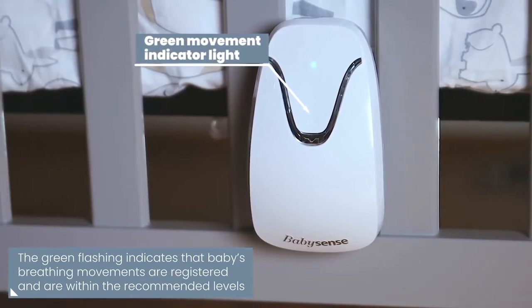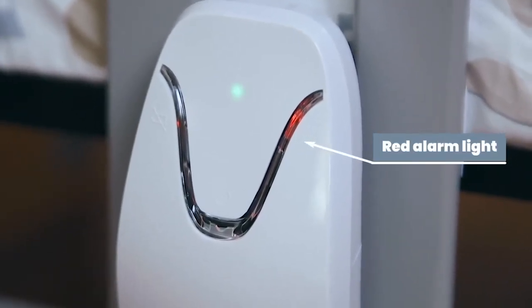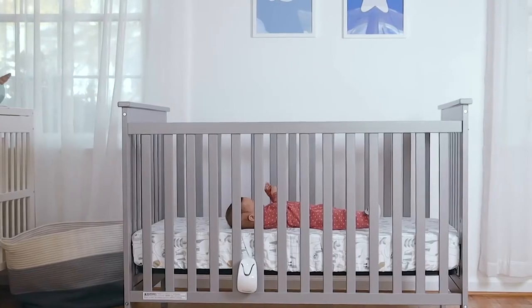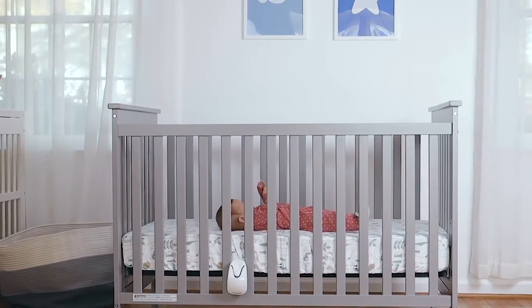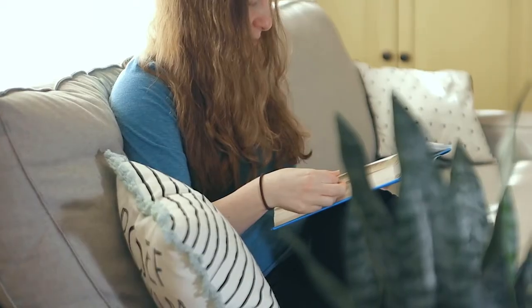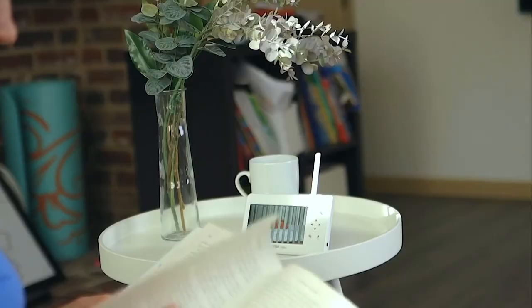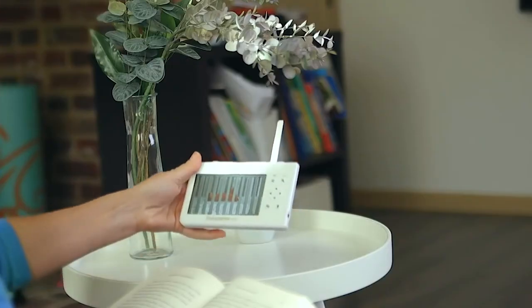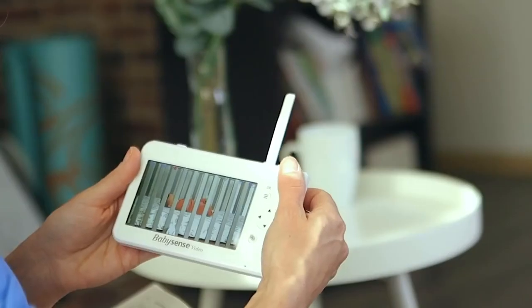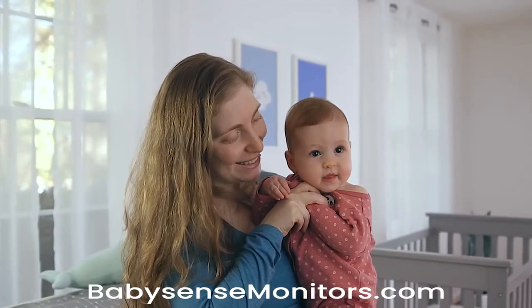If movements stop or drop below the recommended level, an audible and visual alarm will be activated so you can attend to your baby in time. BabySense 7 constantly monitors your baby's breathing movements and alerts you if movements are irregularly slow. Get true peace of mind knowing that BabySense 7 breathing movement monitor is watching over your baby, allowing you the freedom to have some time for yourself. BabySense 7 — keeping your family happy and safe.